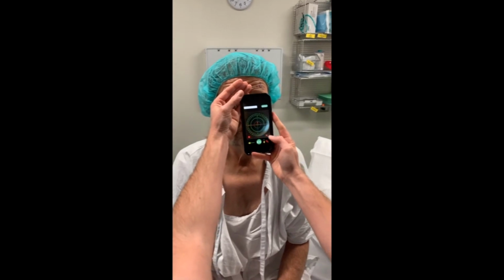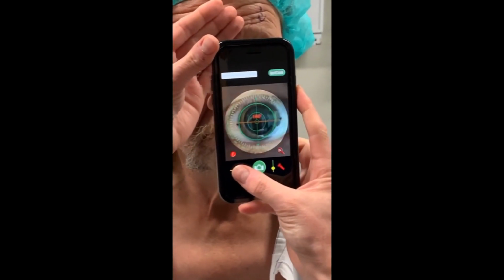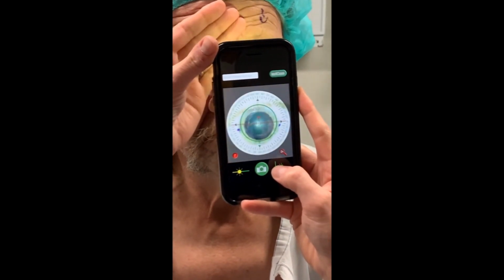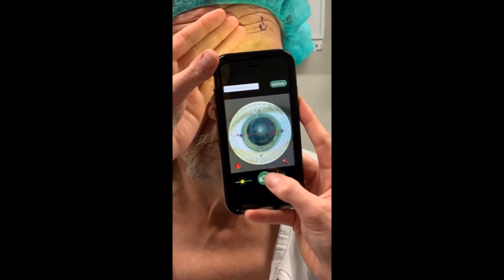So now if I can just get you to look straight at the light on the phone. That's brilliant. Well done.